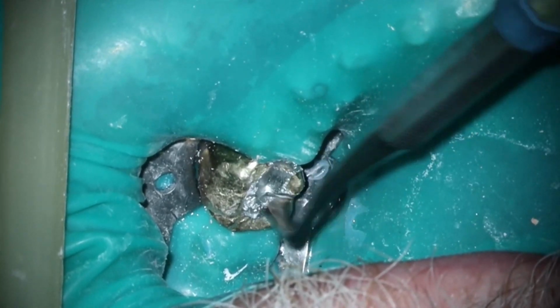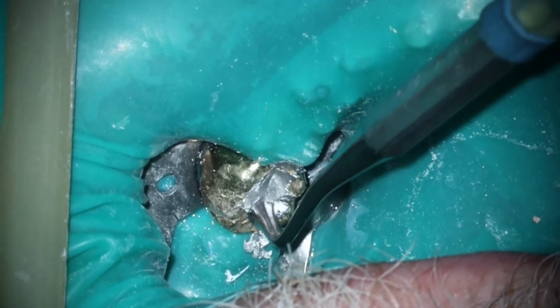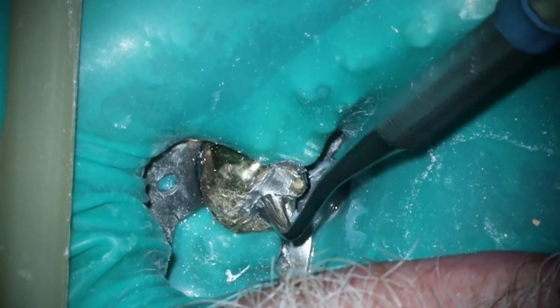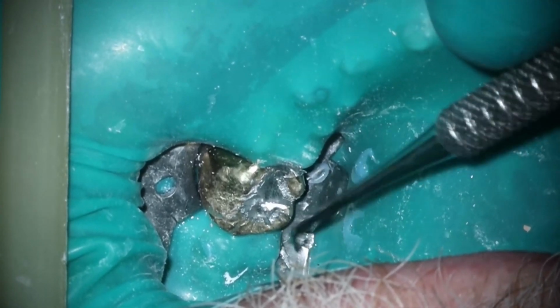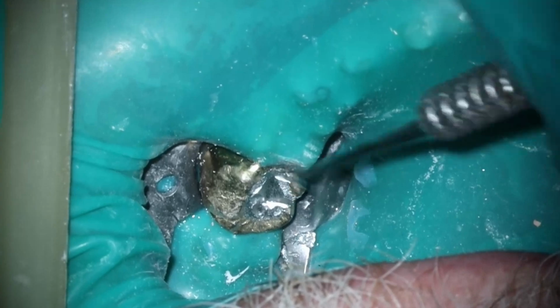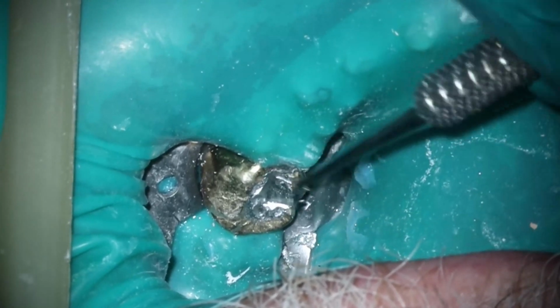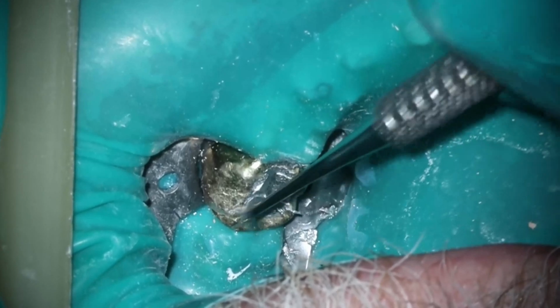Using the acorn here. At UOP, we weren't allowed to have an acorn, which I think is the meanest thing in the world. It makes such a difference in your ability to make amalgams look decent. So dental students, if you are able to bring your own stuff into SimLab and you're having trouble with it, buy an acorn off of eBay, because it makes doing the margins and carving a billion times easier, especially with those traditional GV Black shapes.